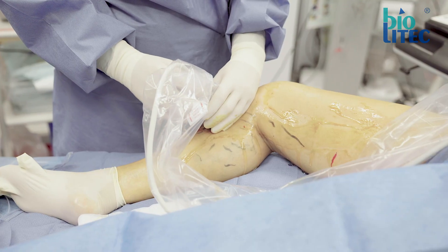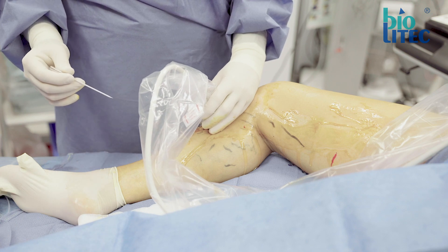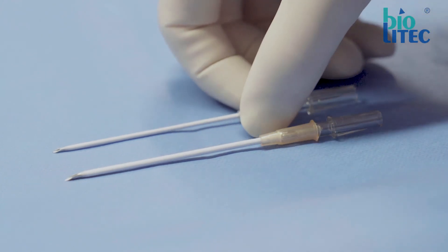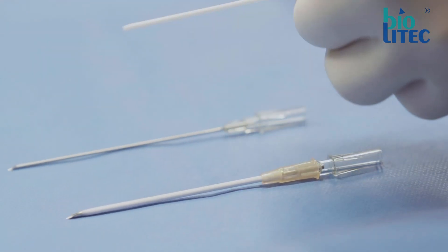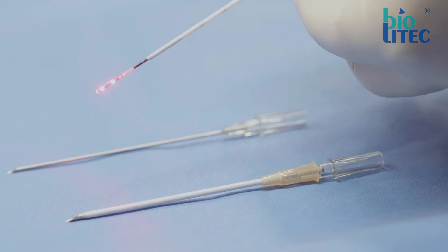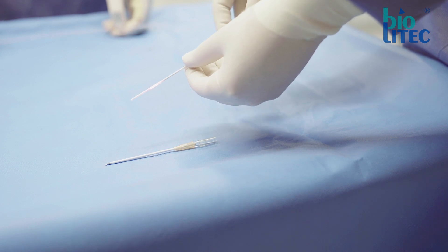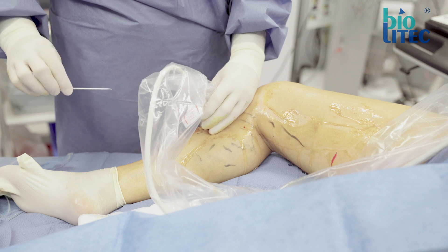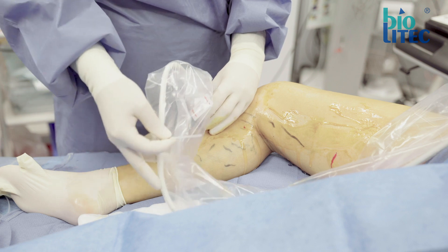Make sure the vein is in the center of the image. By puncturing in the middle of the probe you should end up pretty close to the vein. I always use the same type of needle, as after some time you will become so familiar with it you can almost puncture blindfold. Using a slim type of fiber, a 16 gauge needle catheter is sufficient, yet I prefer a 14 gauge needle catheter to prevent any friction of the laser fiber and because of its stiffness. As you have to puncture at a very shallow angle, the best way to hold the needle is not like a pencil but grabbing it from above.